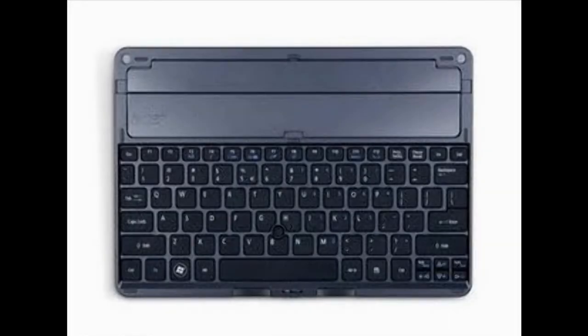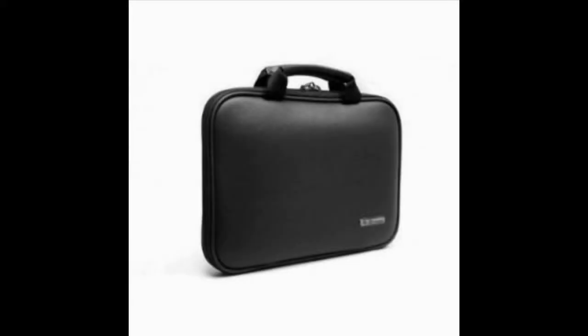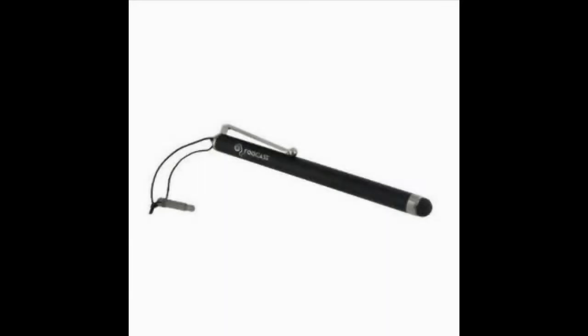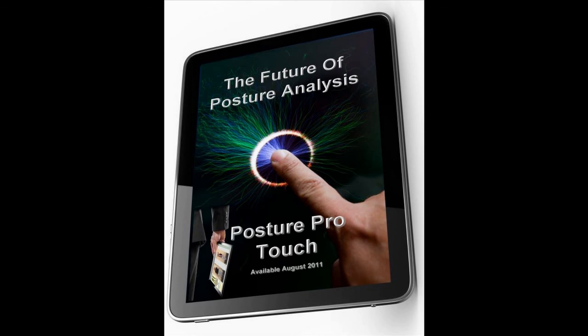The Touch also comes with an integrated keyboard docking system, a built-in leveling system, a padded carrying case, and a screen stylus. Posture Pro Touch represents the finest in technology for accurate and fast posture exams. Visit us online at www.PosturePro.com or scan the symbol on the screen with your smartphone.